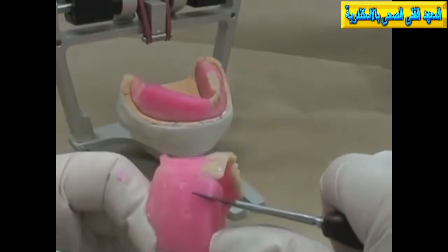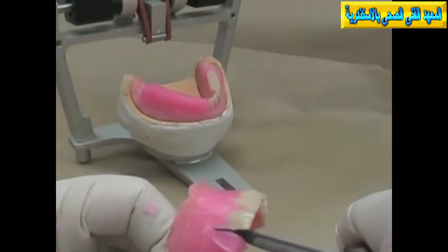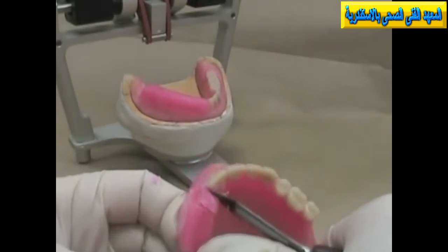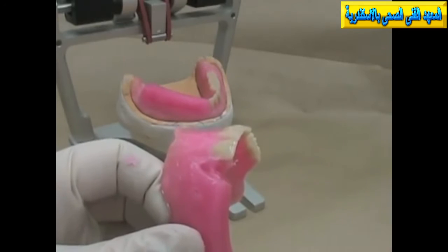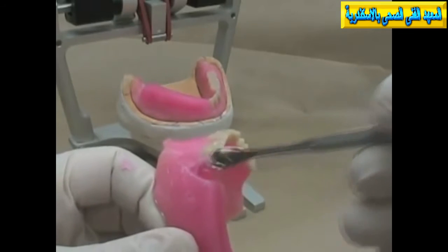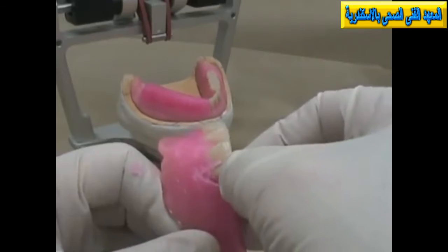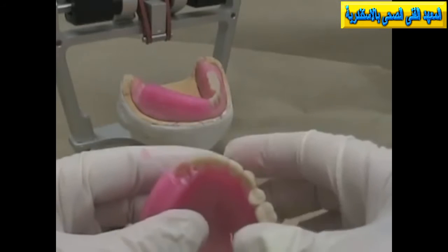And again, remember, as you're removing the wax, use your finger rest so that you don't have a mishap and poke yourself with the sharp. I'm going to soften that, make the wax molten again, and set the lateral incisor. Remember, incisal edge slightly half a millimeter above the edge of the central incisor. The neck of the tooth should be depressed a little bit so it's not quite as prominent at the neck of the tooth. Look from above, take a look at the symmetry with the opposite side.